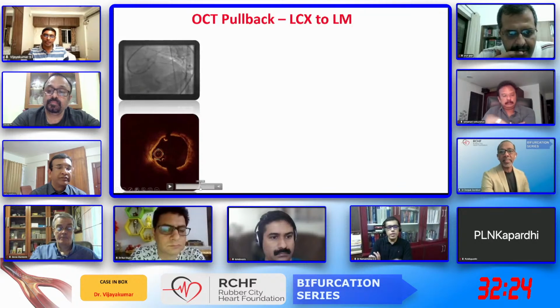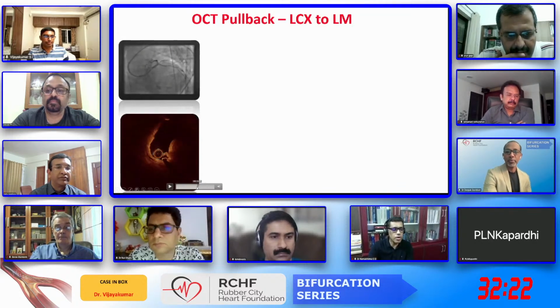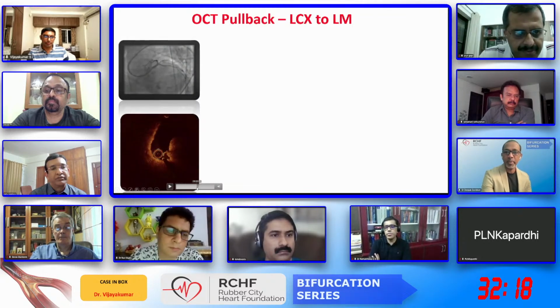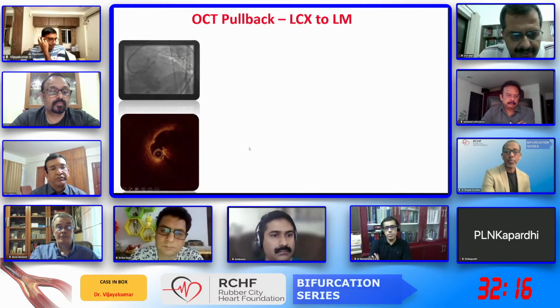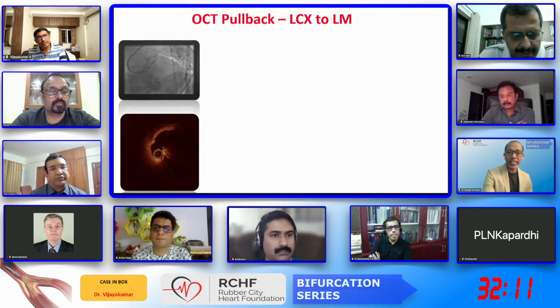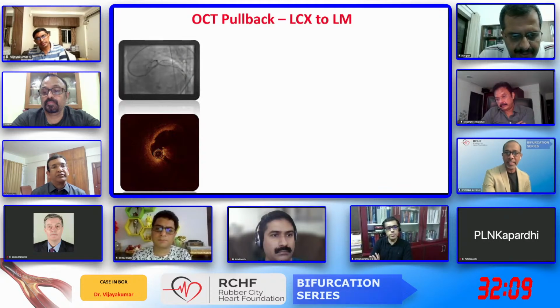Vijay, generally, before doing an OCT imaging, we dilate the lesion if it's a very critical lesion, with a 2 millimeter or, if at all, a 2.5 millimeter balloon, and then go ahead with imaging so that we get an idea regarding the morphology very clearly. But then you even went ahead with a scoring balloon.